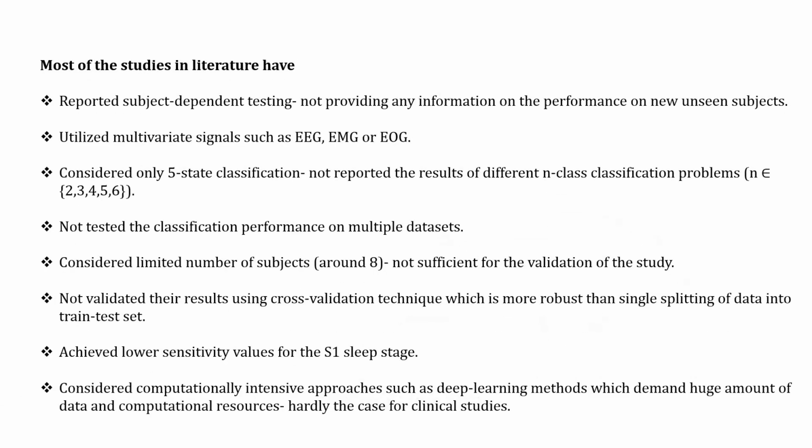Now here we have reported some of the major flaws in previous literature. That is, most of the studies have actually reported SDT, which does not provide any information on the performance of new unseen subjects, which is very much required for practical purposes.